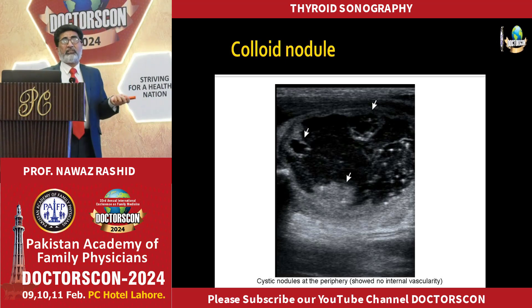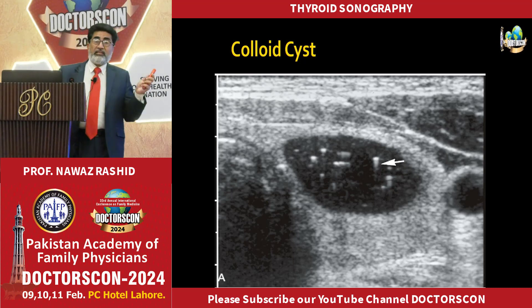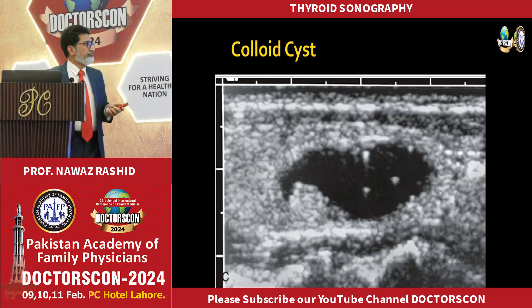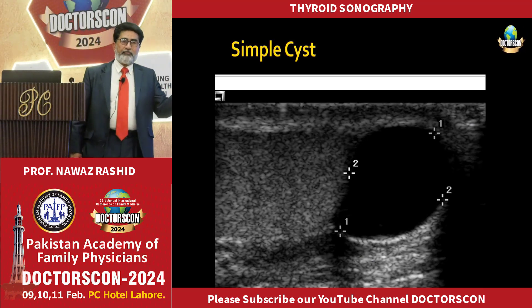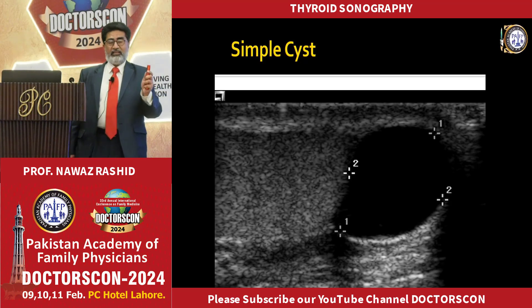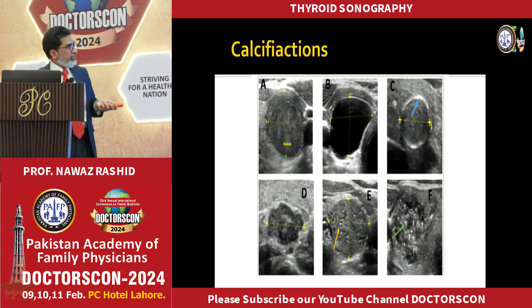This is the comet-tail artifact, which is present in the follicles of the thyroid. This is a cardinal sign — if you see comet-tail artifacts, it is benign unless proven otherwise. Differentiate a simple cyst from a colloid cyst: colloid cysts show comet-tail artifacts due to glycoproteins. Peripheral calcification is also a benign finding; punctate calcification can also occur.